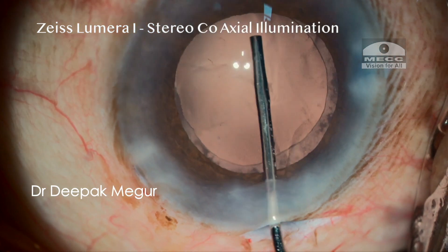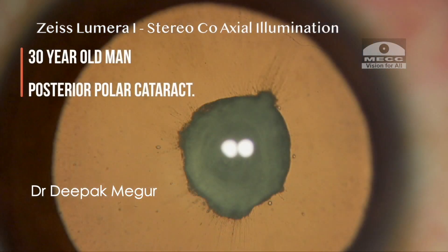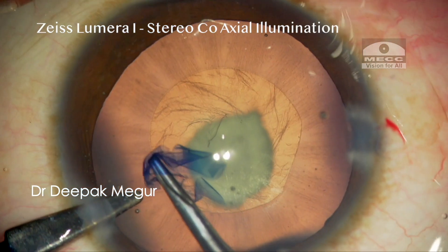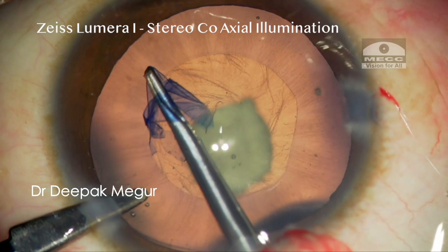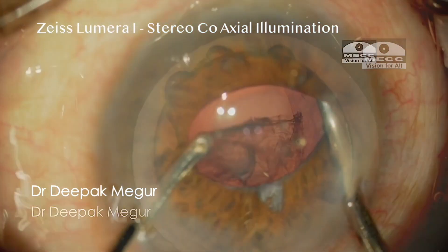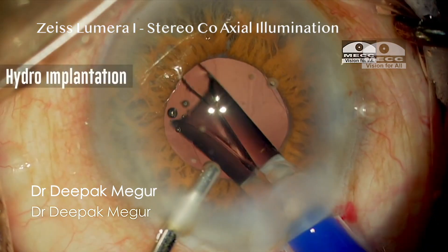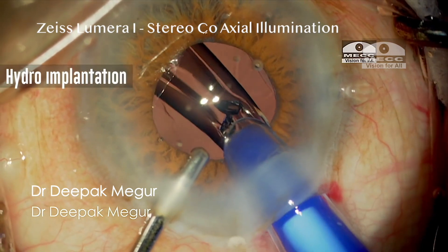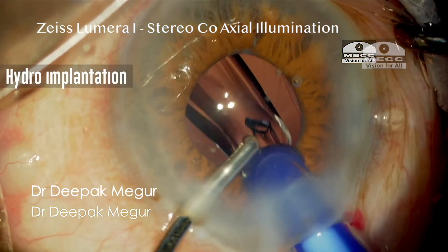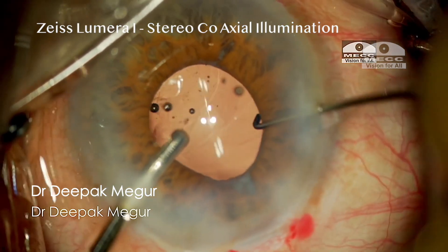Typically, this can be identified by the presence of three light reflections, or by only two reflections in the pure coaxial mode. The magical red glow which we get with the system, irrespective of the pupillary diameter, enhanced the safety of cataract surgery and made life easier for us, especially in difficult cases, and improved outcomes by leaps in complex case scenarios.